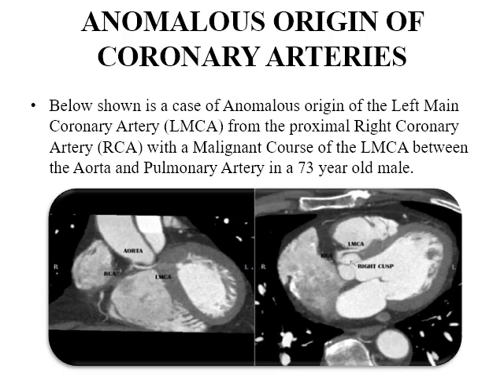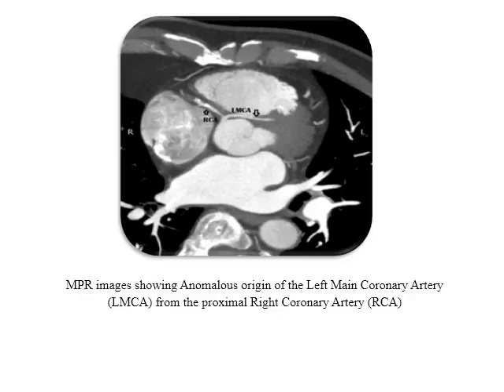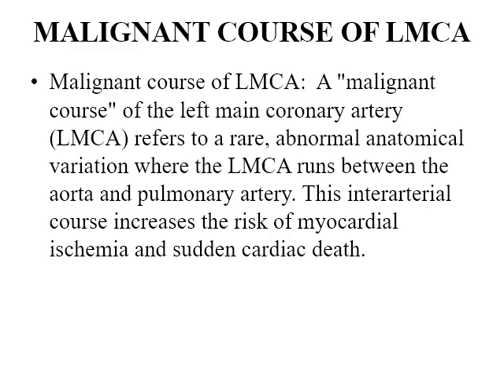The anomalous origin case shown demonstrates the left main coronary artery arising from the proximal right coronary artery with a malignant interarterial course between the aorta and the pulmonary artery. The malignant course of the left main coronary artery refers to a rare abnormal anatomical variation where it runs between the aorta and the pulmonary artery. This interarterial course increases the risk of myocardial ischemia and sudden cardiac death.